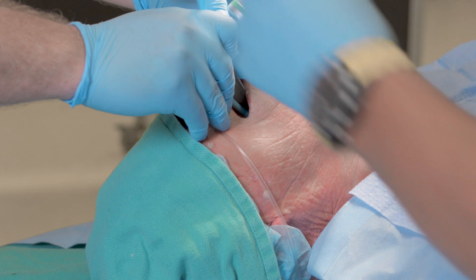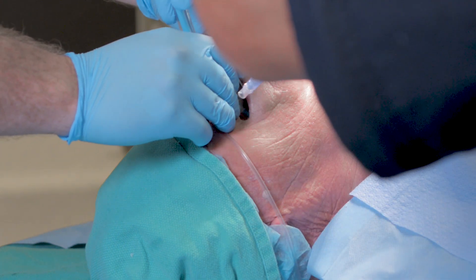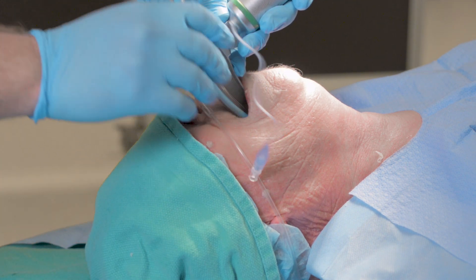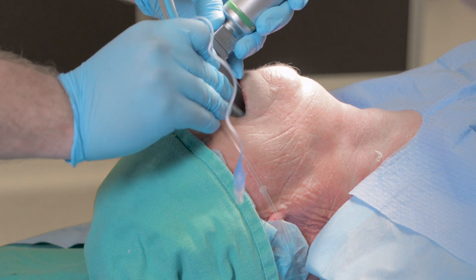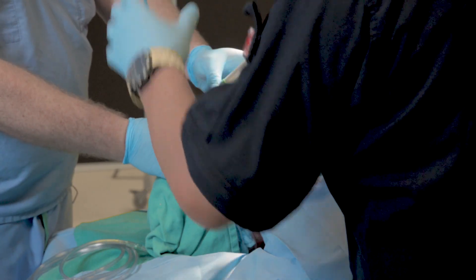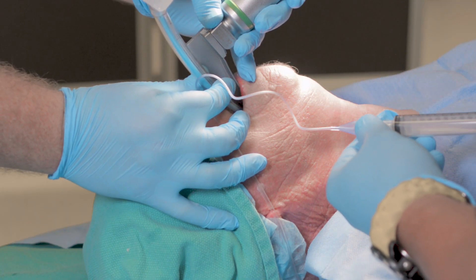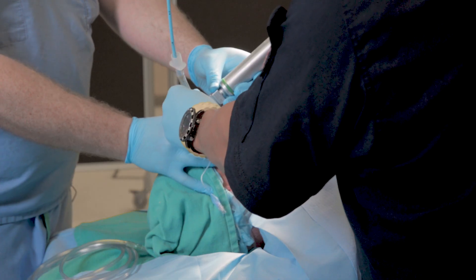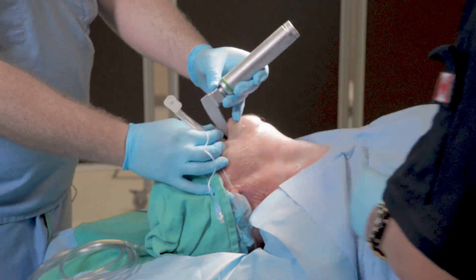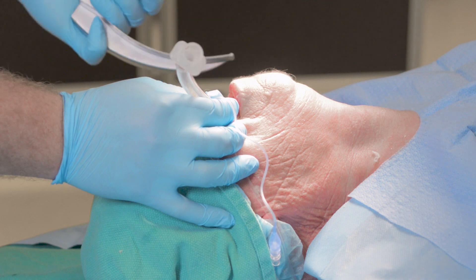Once that bougie comes to its hard endpoint, your assistant will load the endotracheal tube onto the bougie and advance it down to your fingers. At this point, you take control of the endotracheal tube, advance it along the bougie, through the vocal cords, holding onto the endotracheal tube as your assistant inflates the cuff and removes the bougie. It is only at this point that you remove the laryngoscope, allowing those soft tissues to collapse down against the endotracheal tube.